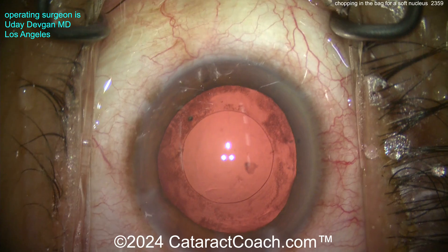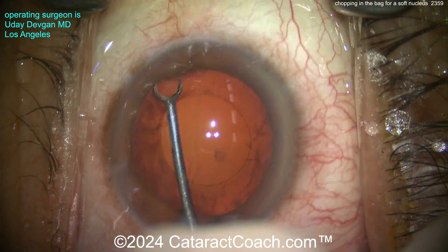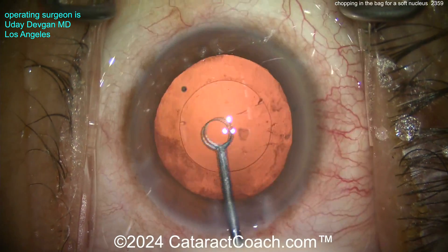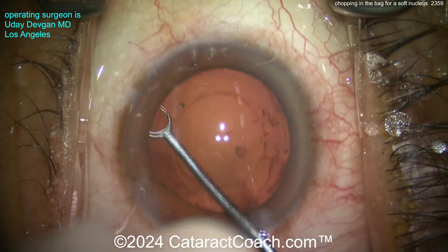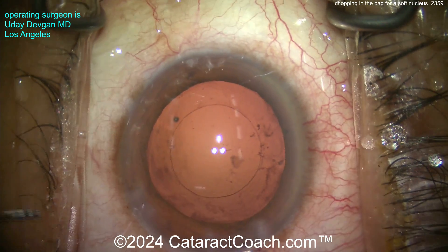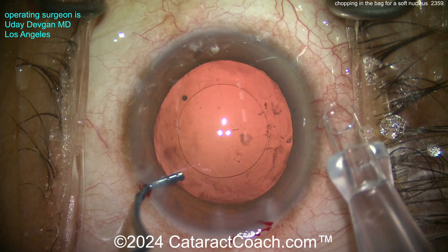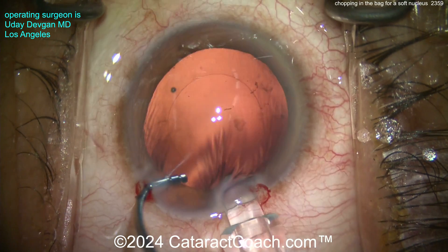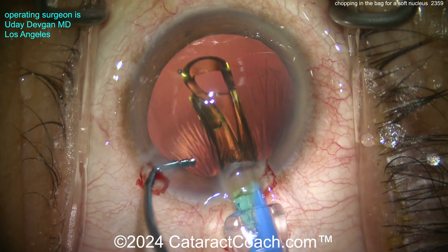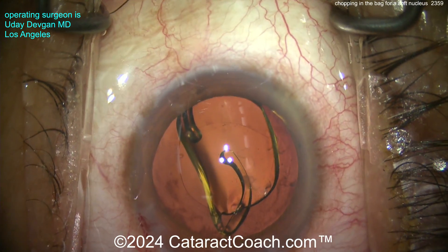There's the nice-looking capsulorrhexis. Get that bag inflated with cohesive viscoelastic. Let's do a little capsule polishing here — clean up the undersurface of the anterior capsule rim. This only takes a few seconds and should give us a beautiful result. This patient elected for a monofocal lens with a goal of plano emmetropia. Here comes the preloaded six-millimeter optic.